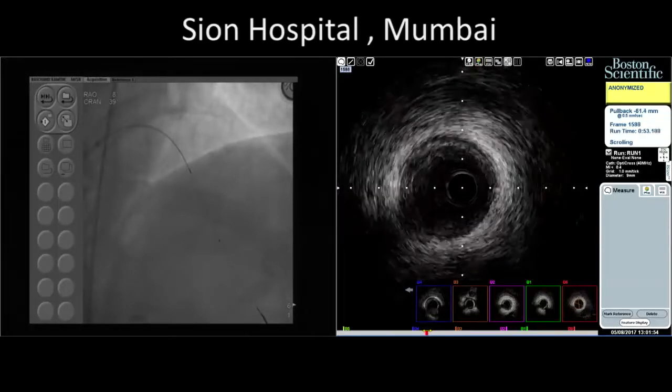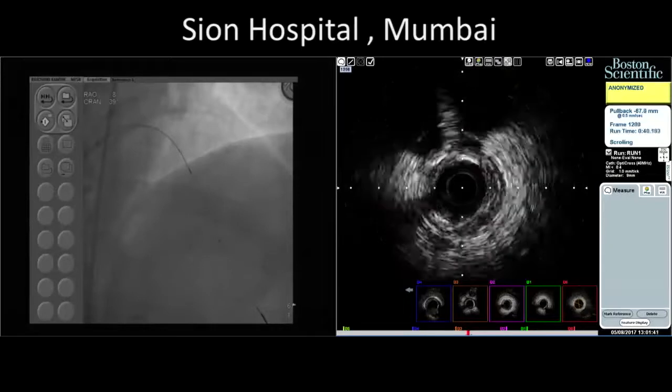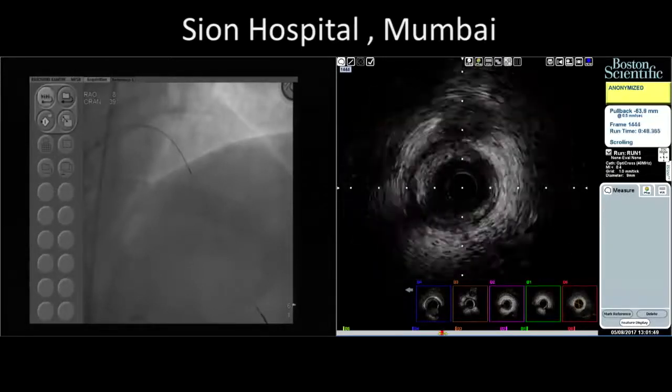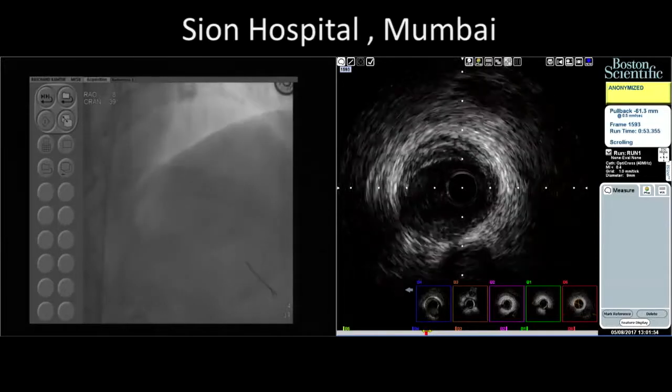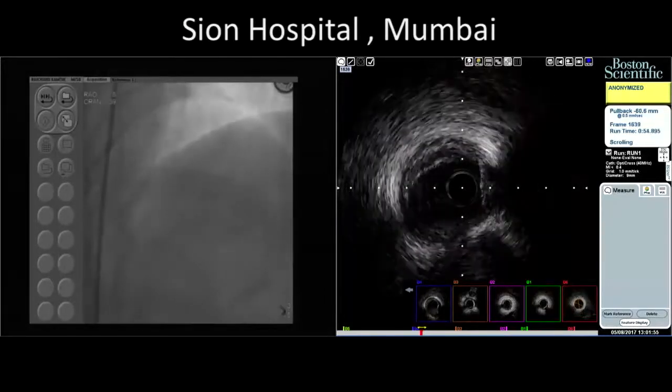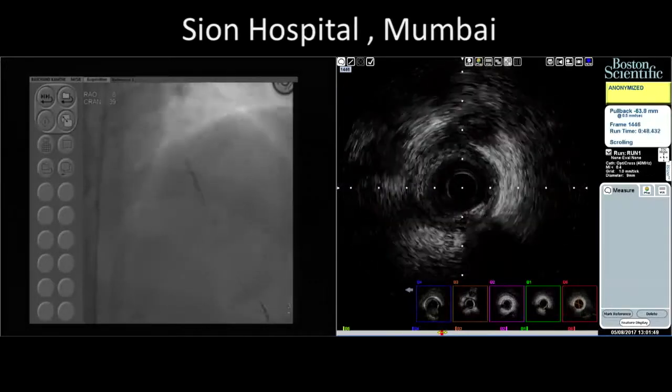Could I use a smaller one? Show the last picture. Okay. Shorter length, I mean, shorter length. Minus. Yeah. Plus. Plus. Good.